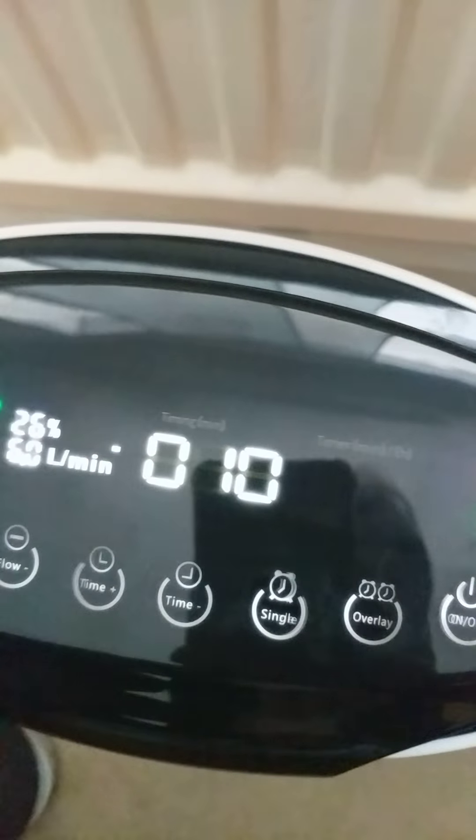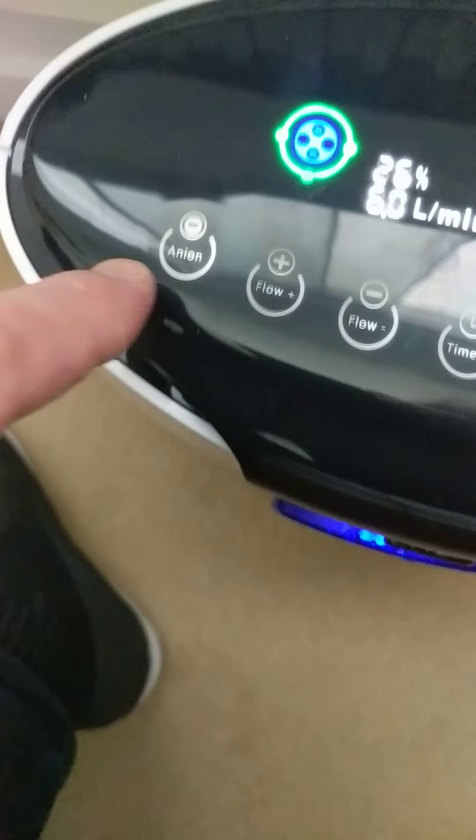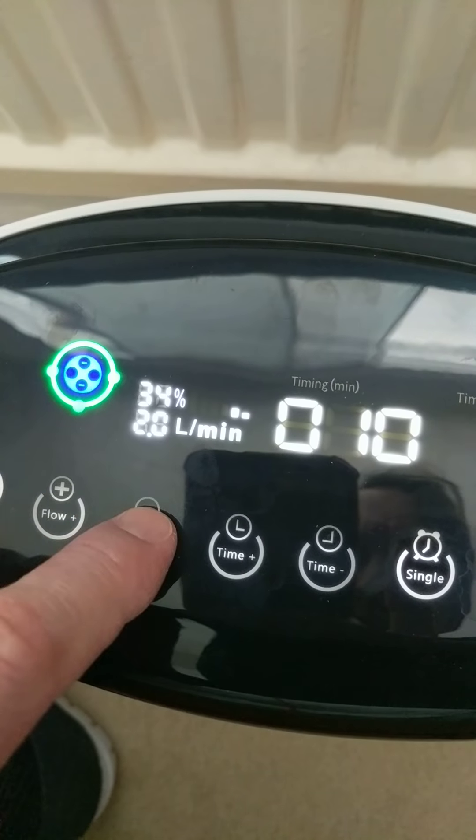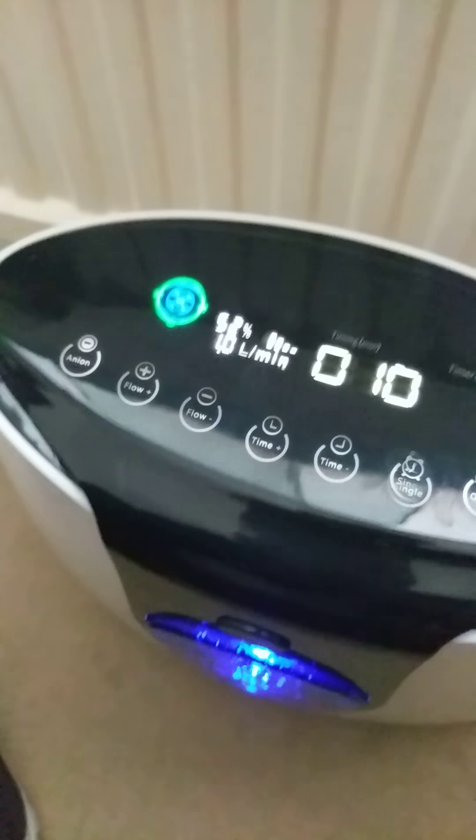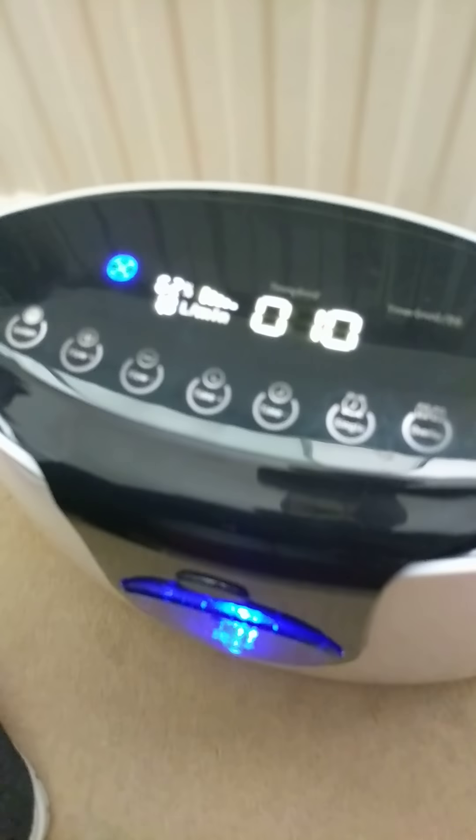So there we go. Let's put it back down to one litre. Very brief review — hope it's useful. Thank you.